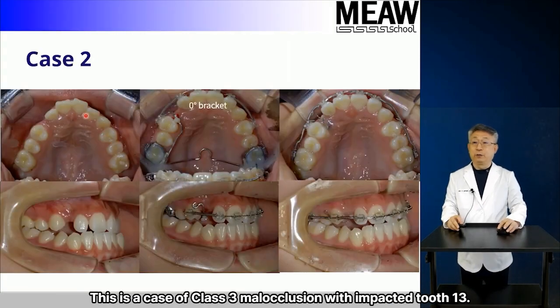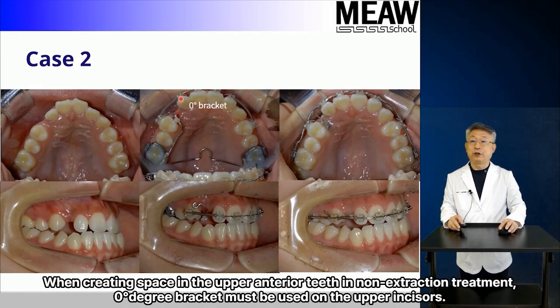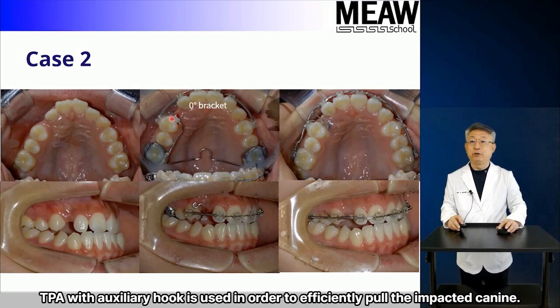This is a case of Class 3 malocclusion with impacted tooth 13. Tooth 13 has to be pulled while space is created. When creating space in the upper anterior teeth in non-extraction treatment, 0-degree bracket must be used on the upper incisors. Taking the direction of impacted canine into consideration, TPA with auxiliary hook is used in order to efficiently pull the impacted canine.